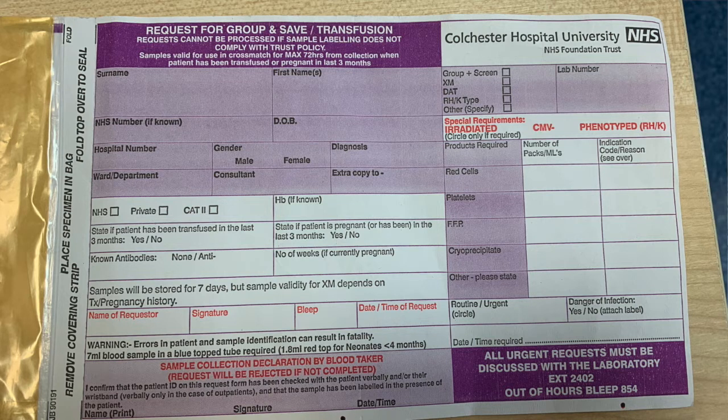There's then a few details down below which you can fill out. It then says the name of the requester, which you have to put in, and at the bottom here it is whoever has taken that sample must be the person who signs this, and it says, I confirm the patient's ID on this request form has been checked with the patient verbally and or their wristband, and that the sample has been labelled in the presence of the patient.